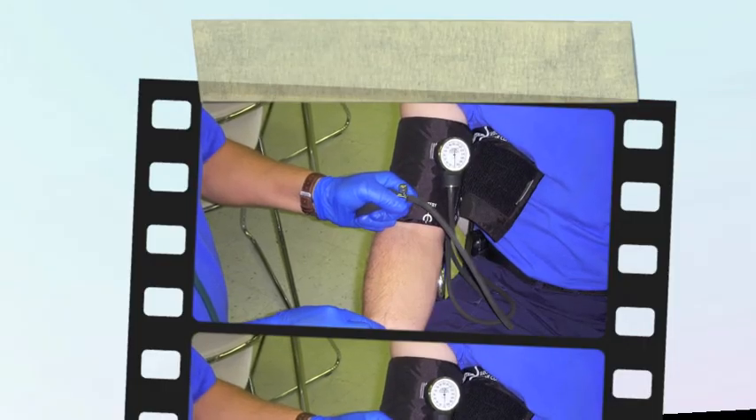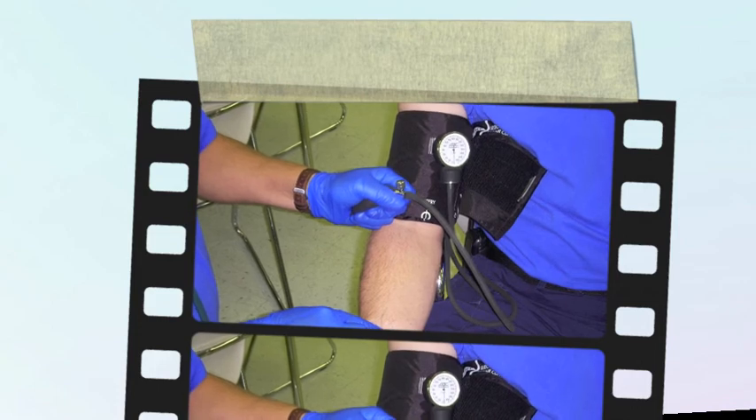When using the palpation method, place your finger on the radial artery to feel the radial pulse.